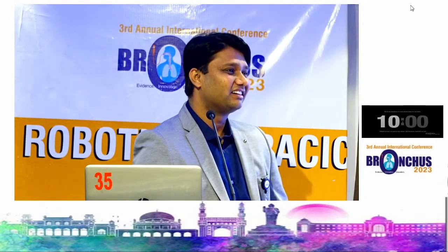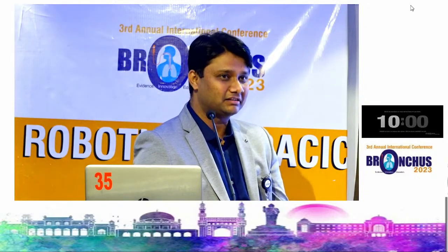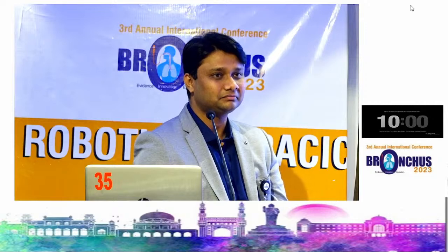The only thing is, in conventional open lung surgery, we like the lung to be in our hand. That makes it feel safer. That's probably why the fifth space felt much more like a natural lobectomy. Yeah, I agree. That is the fallacy of the procedure. That's the first thing I told. The fifth space, it looks so beautiful.